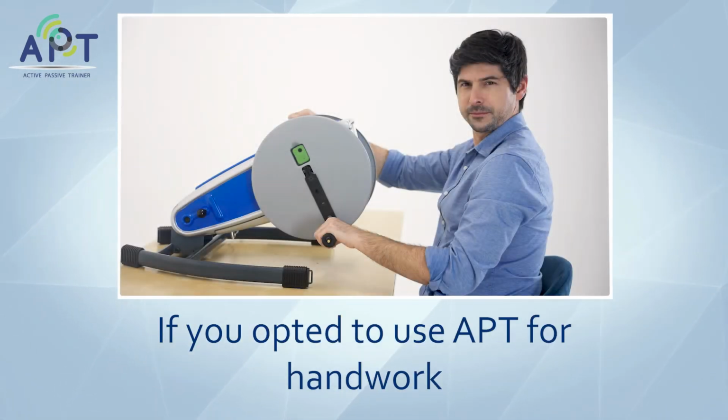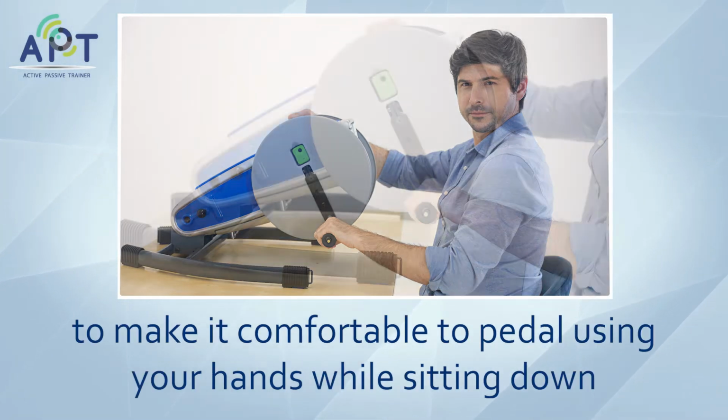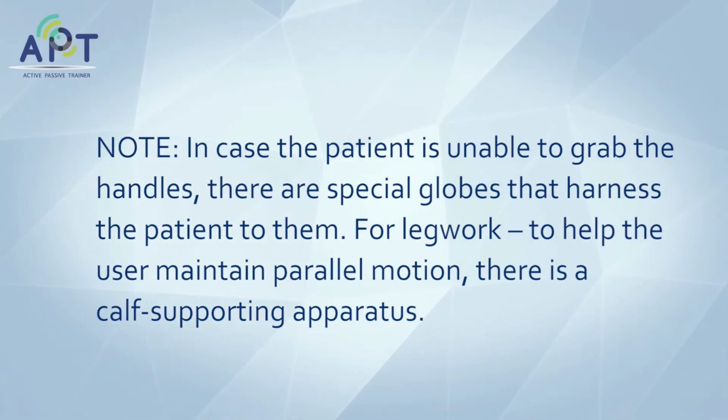If you opted to use A.P.T for handwork, place the A.P.T on a table and adjust the height to make it comfortable to pedal using your hands while sitting down. In case the patient is unable to grab the handles, there are special gloves that harness the patient to them. For legwork, to help the user maintain parallel motion, there is a calf supporting apparatus.